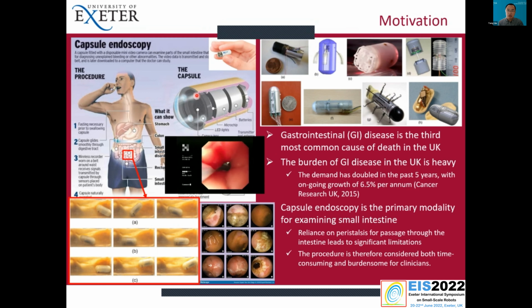They employ a miniaturized camera in the capsule, and the patient swallows it. Because the capsule is passive, it is driven by the peristalsis of the patient's gastrointestinal tract. This gives the capsule a number of limitations. As you can see in this figure, the capsule is stuck somewhere in the GI tract, so the clinician needs to perform surgery and remove the capsule.